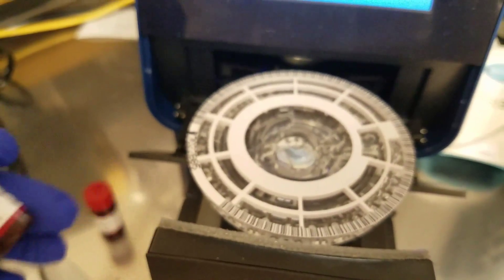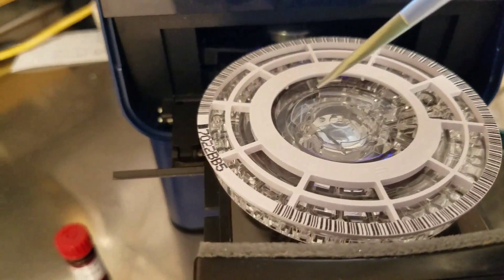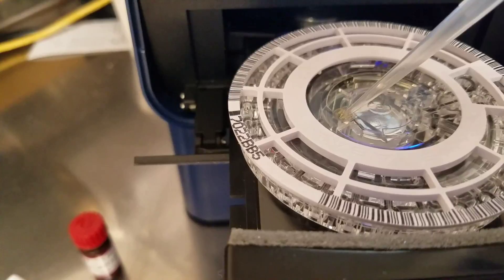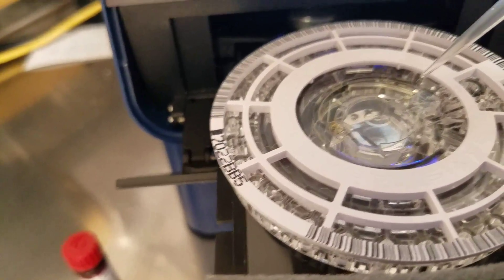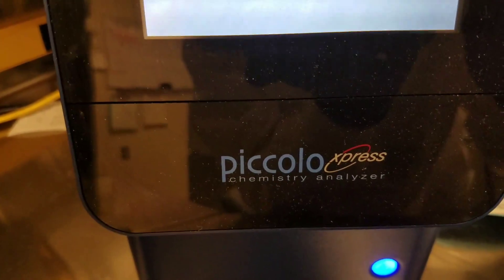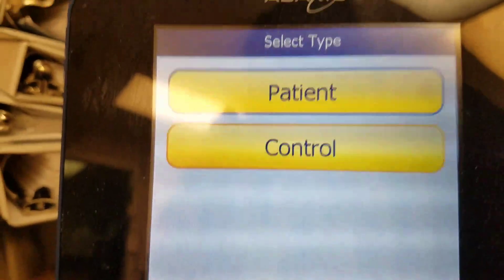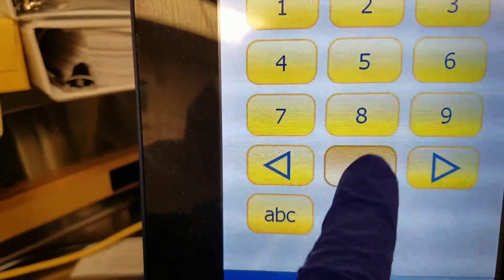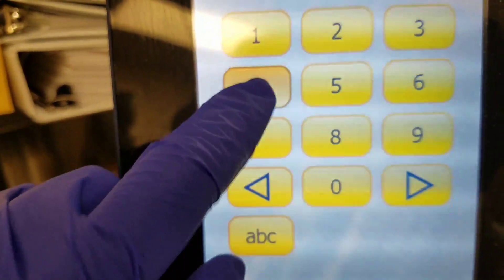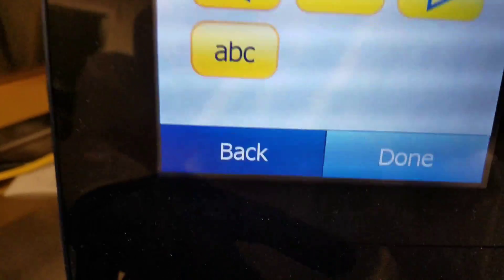I'm going to run level one first. Here's my sample. We mixed it up, and now we are adding it slowly to that well, and you can see it fills up all the way around to over here. We're going to dispose of that pipette, and then on the screen it says close drawer to analyze sample. So we will hit close, and then it takes it in. This is where if you were running a patient, you would put in the patient and patient number, but we are running a control, so I'm going to put in my control number. And then we're going to hit done.